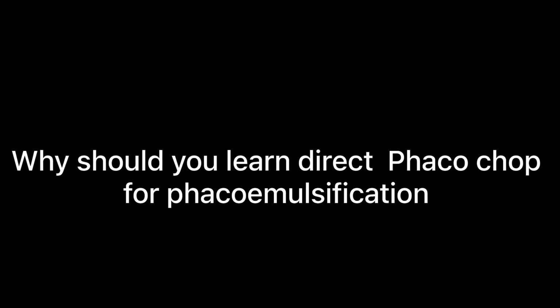Hello my dear friends, this is Dr. Magan Patel, Eye Care and Laser Center. In this video I want to show you why you should learn direct phaco chop for phacoemulsification.